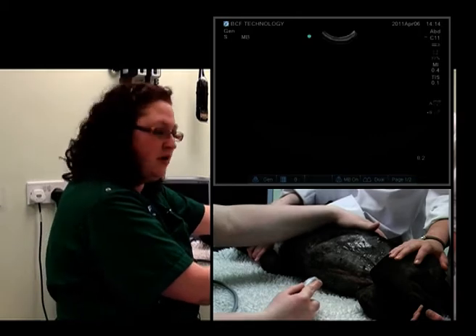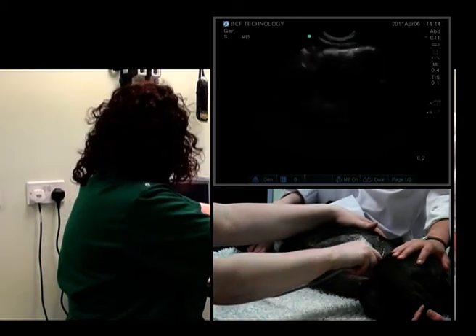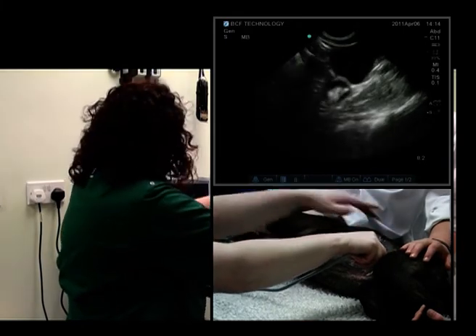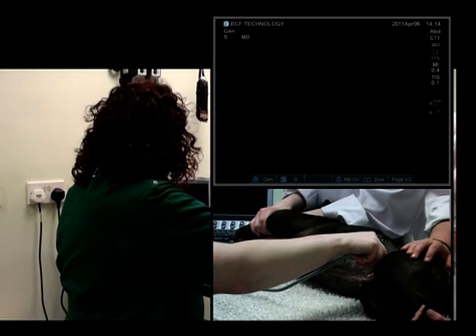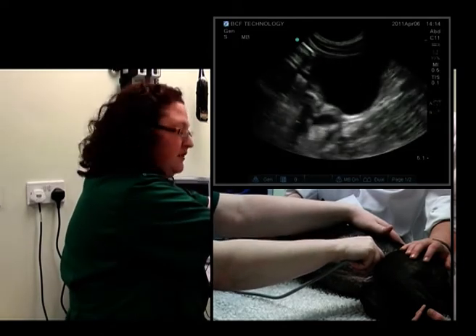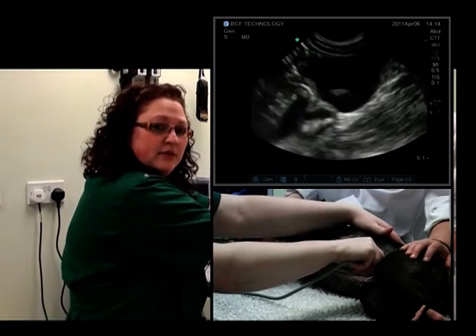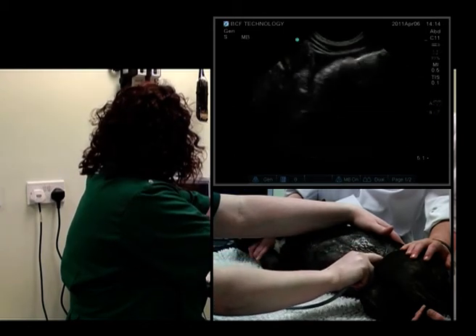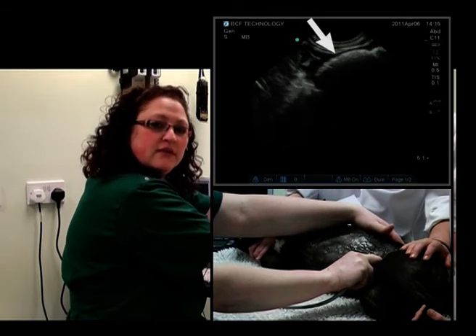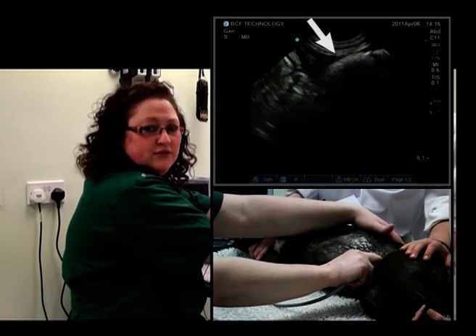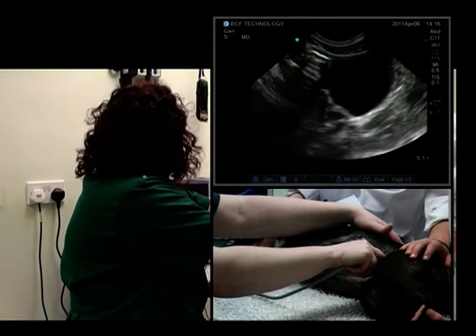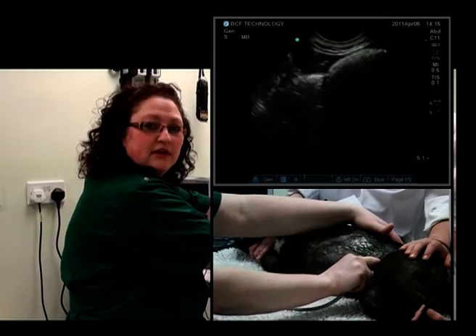Once we get to the caudal abdomen, we can stop at the bladder, which we've seen previously — there it is at the top of the screen. We'll need to change depth just now. The colon is located just dorsally to the bladder, so we can fan up and see the colon as it starts to come into view. We won't be able to see too much beneath it because of the amount of gas in there causing a shadowing artifact. Back to the bladder, and scanning up to the level of the colon.